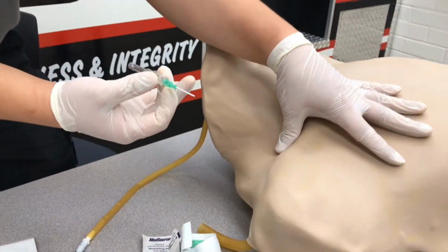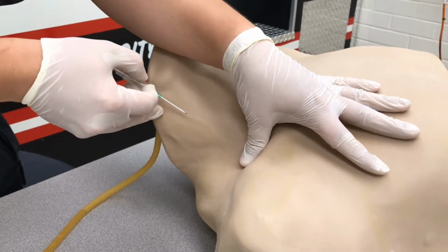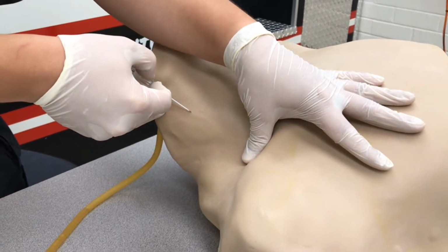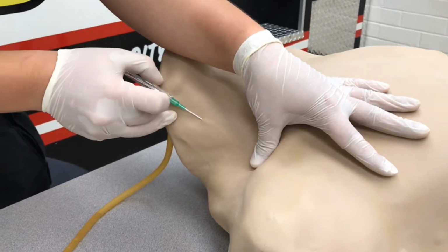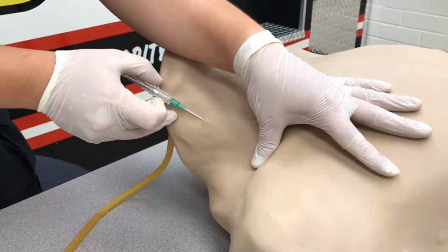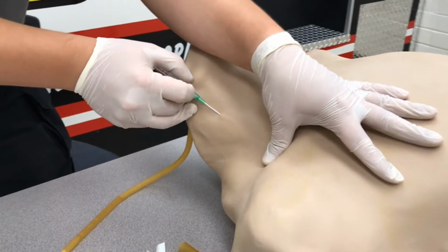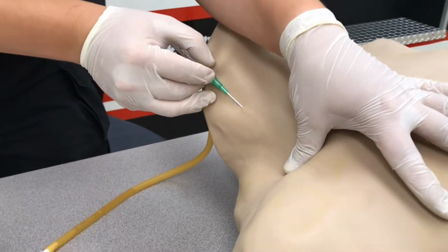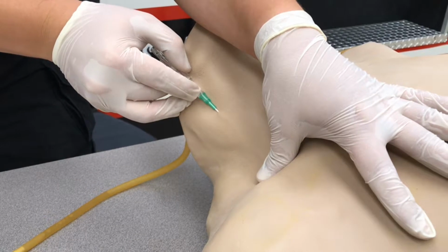So I'm bracing on the clavicle and on my forearm here, and I see my vein. I'm going to go in at a shallow angle and insert, feeling for a pop, and also looking at my flash chamber to see if there's a flash. You're not always going to get a flash with EJs. If you don't, just go ahead and insert your catheter, and it should feel pretty smooth going in. If you meet resistance, it's likely not in the right place.